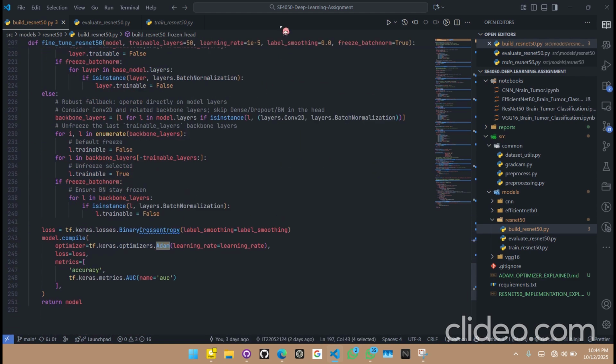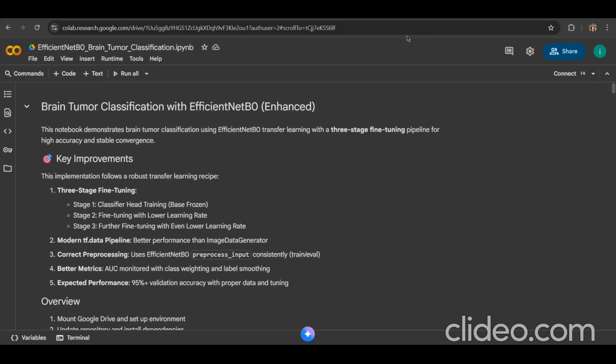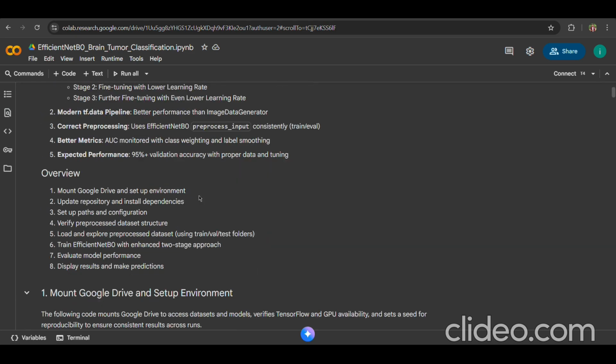And thank you. Hello, I'm Shadir Fawz, and my IT number is IT 222, and I trained an EfficientNetB0 model for brain tumor classification using MRI scans, and it allowed me to get an accuracy of approximately 97%.